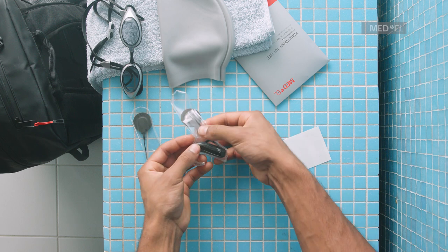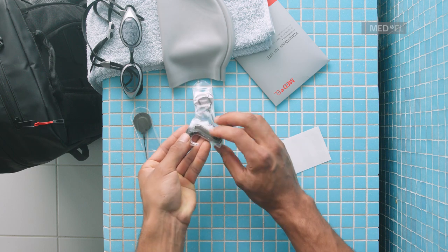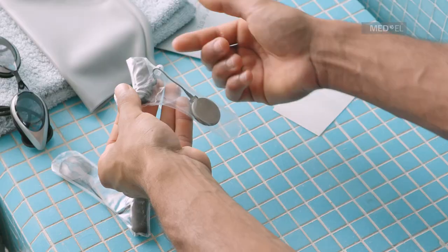Make sure Waterwear fits snugly around the entire processor without any wrinkles or bubbles, and check that the coil cable is not twisted inside the cover.